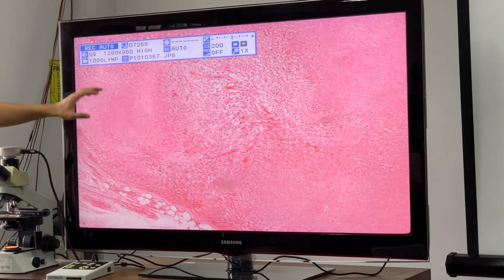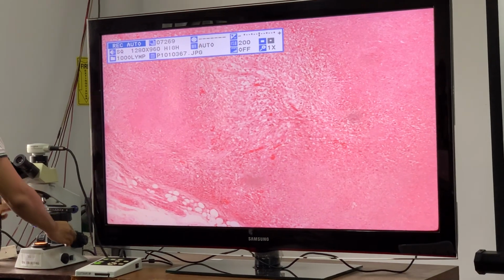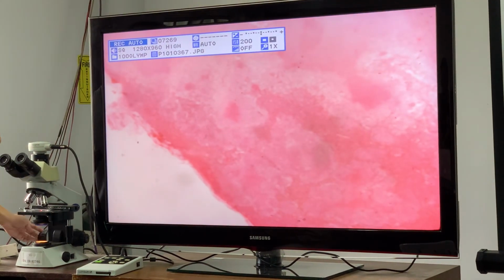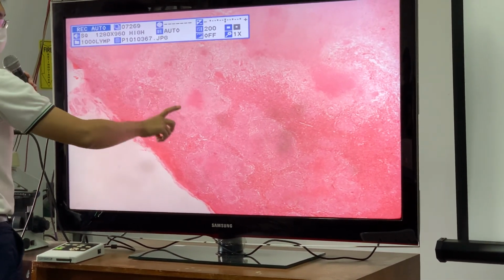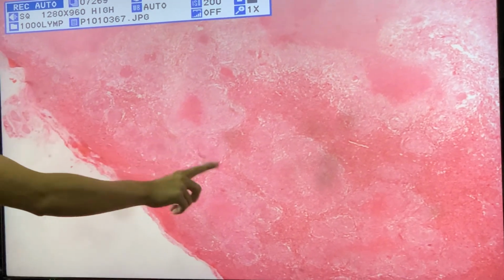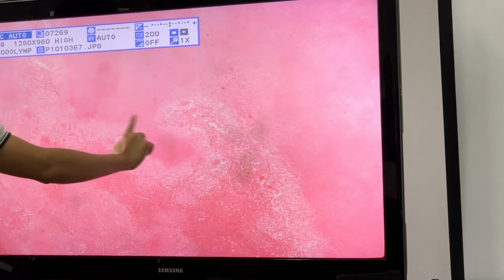The amorphous pink center is a circular structure. Let's see if you can find a better one. This is a granuloma. Here's the patient's one. Okay? The granuloma. There's a lot actually. There are several granulomas of varying sizes. There's another one here. Some of them have caseous necrosis. There's another one. This one is oddly shaped. This is the caseous necrosis part. Here's the granuloma.